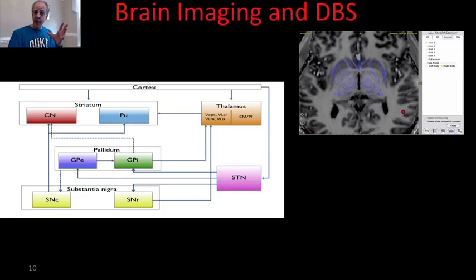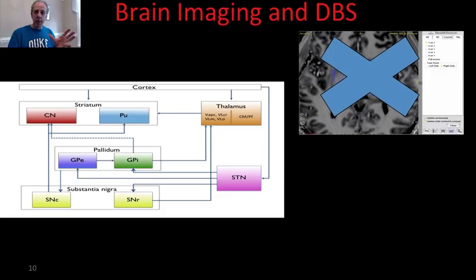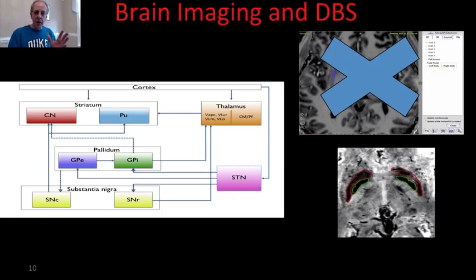And then they use an atlas. They have an atlas of brains, and they know where those different regions are in the atlas, and then they get some imaging for that particular patient, and they try to locate those regions in the images of that patient using this atlas. Now, one of the challenges, with the help of new acquisition techniques and new image processing techniques, is not to use the atlas anymore and to do everything with images from that subject.